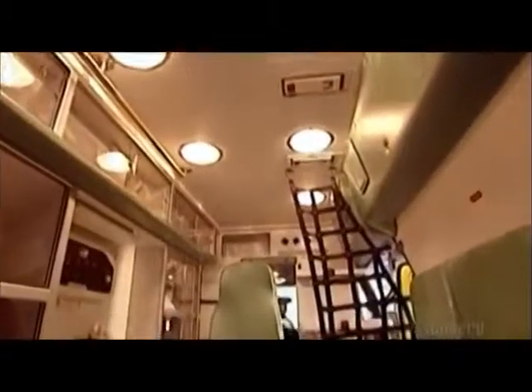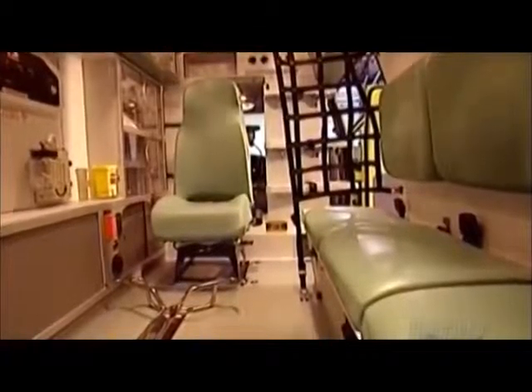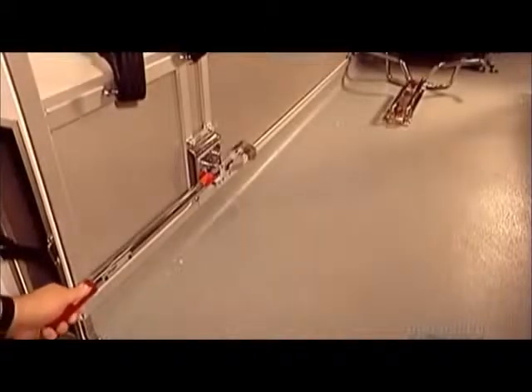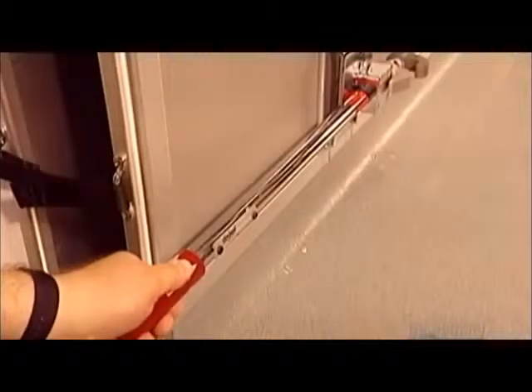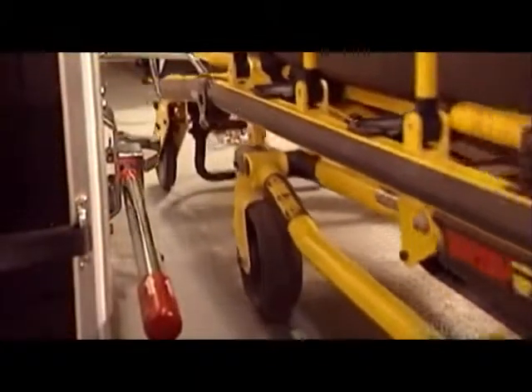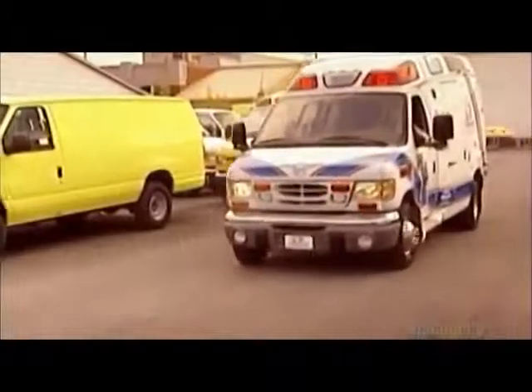A safety net by the three-seater squad bench protects the crew should the ambulance come to a sudden stop. This mechanism holds the stretcher in place while the ambulance is moving — the stretcher simply locks in, keeping the patient safely immobile until the ambulance reaches the hospital.